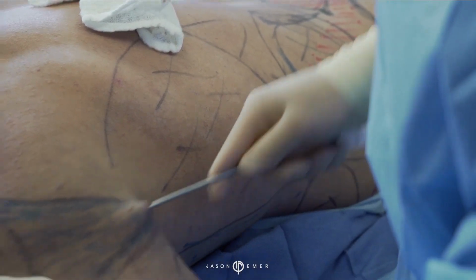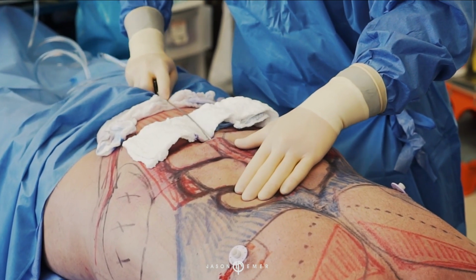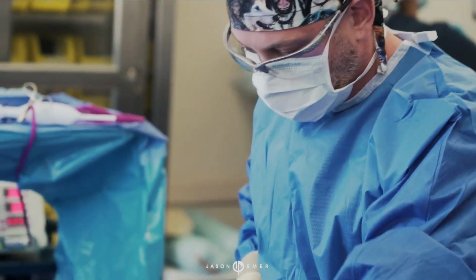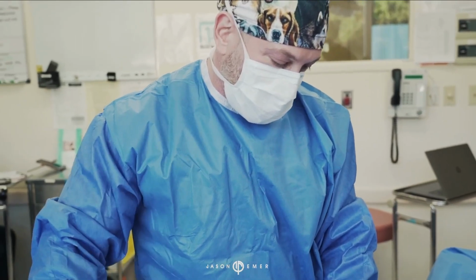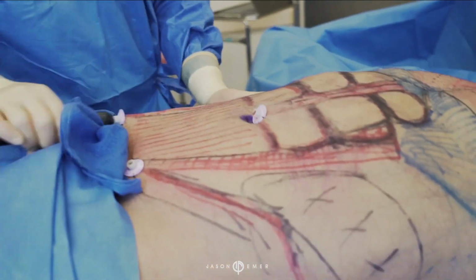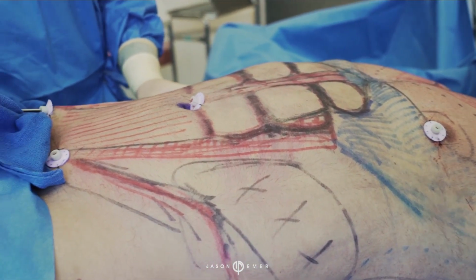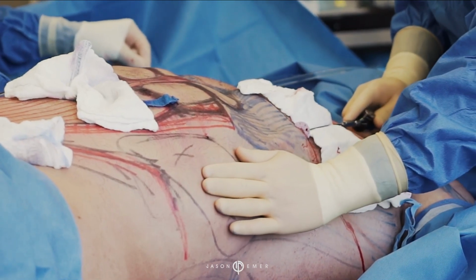Give him that more rounded, sculpted look. When someone's this lean, you need a good amount of tumescent to really get the ability to sculpt the area. So now we're doing Vaser on the front of his stomach, because this is the most important area. He wants sculpting. So we're going to work to melt the superficial fat, really push it aside. The fat cells are safe for use in grafting.